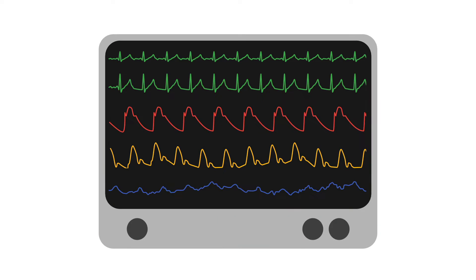Finally, a blue waveform is across the bottom of the screen. This is a venous waveform. Although it's a little noisy, it shows A and V waves followed by the X and Y descents. This is the central venous pressure measurement. This waveform comes from a side port of the PA catheter, which is at the level of the right atrium.